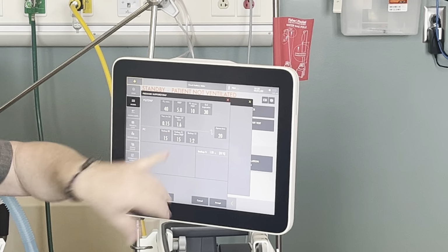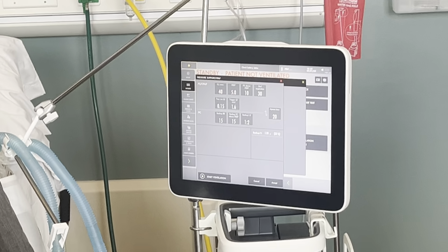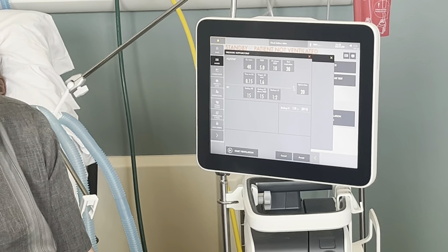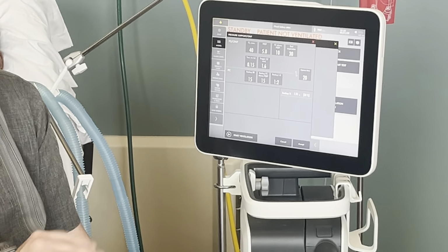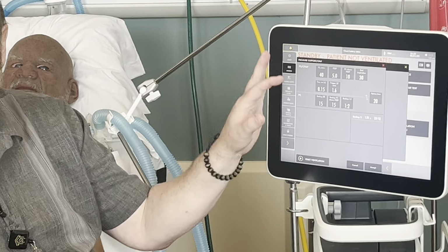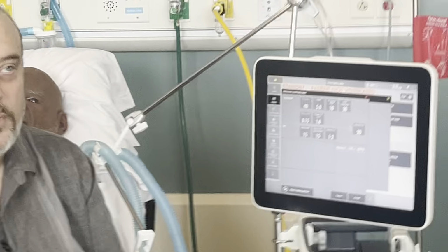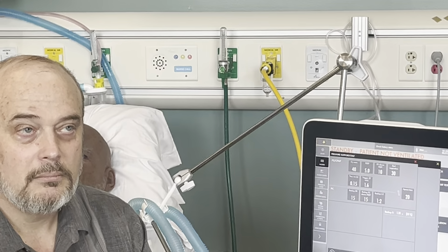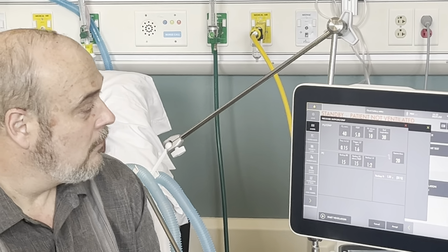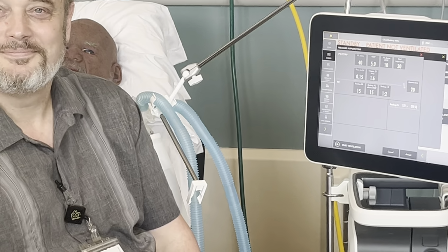5. If I took them off this ventilator, and the doc said, yeah, go ahead and extubate, and put them on the BiPAP, put them on the Servo U with the same settings. Well, not a Servo U, that's not fair because it works the same way. But let's put them on a V60, let's say. So what settings would I use? Because that's BiPAP instead of CPAP pressure support. 5 over 15. Well done.